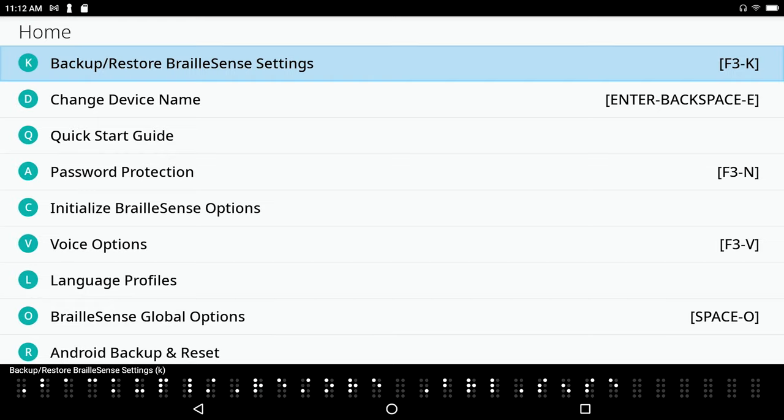But the things that you care about, like I said before, is the stuff that you've created. You know, let's say your emails and your, everything, your word processor documents or your notepad documents. So let's go back, file manager.